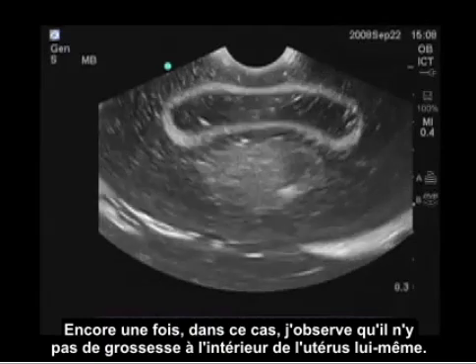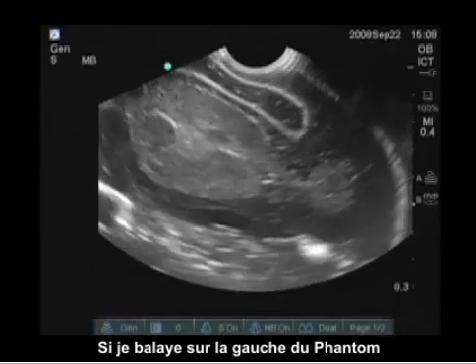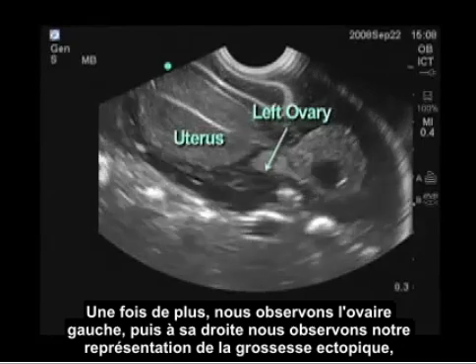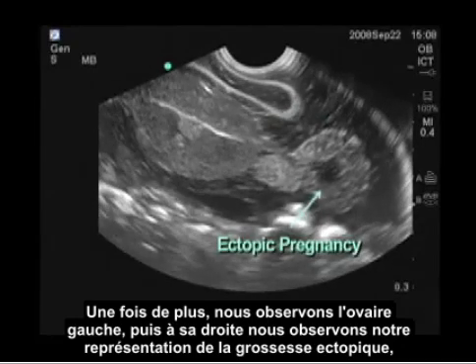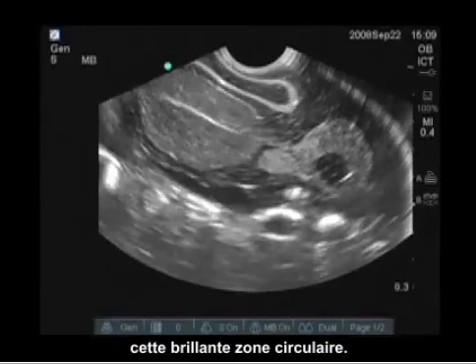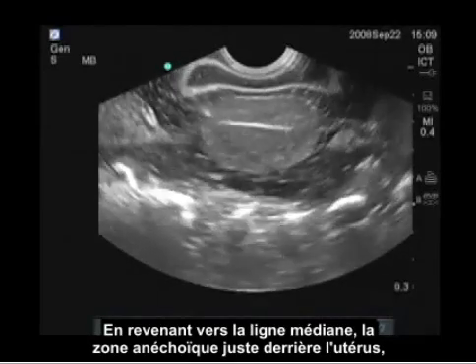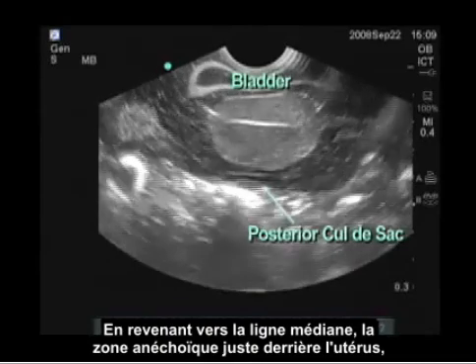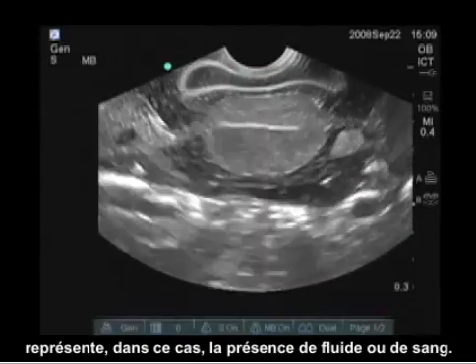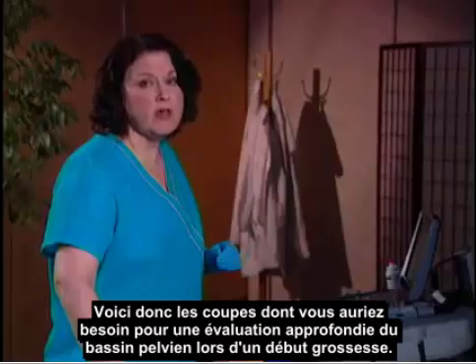In the coronal view, I can see there is no pregnancy inside the uterus itself. Scanning over to the left of the phantom, we see the left ovary, and right beside it, our representation of the ectopic pregnancy — this bright circular area. Moving back towards the midline, the anechoic area just posterior to the uterus represents free fluid or blood. Those are the views needed for a thorough assessment of the pelvis for early pregnancy.